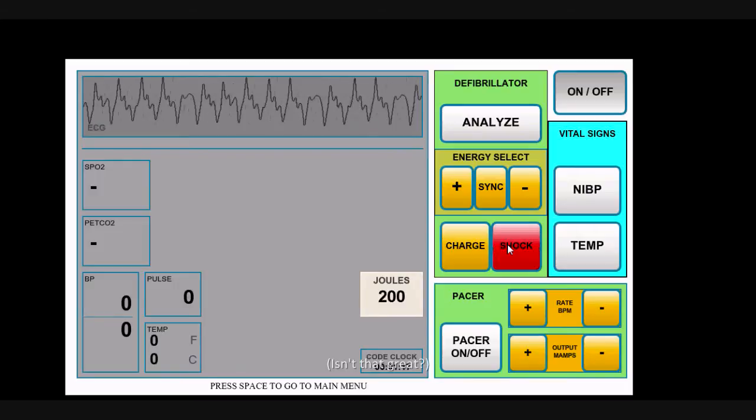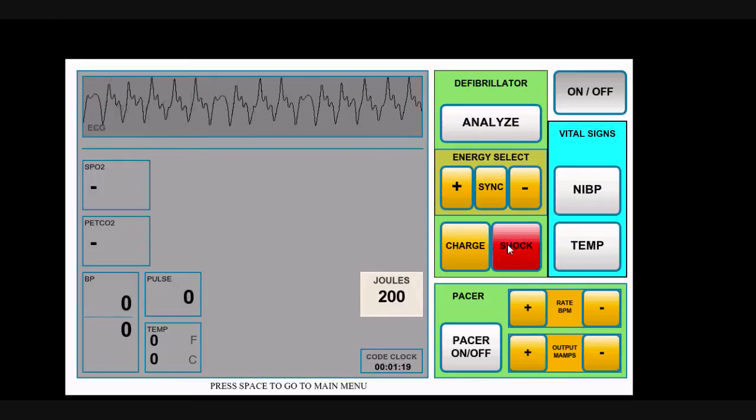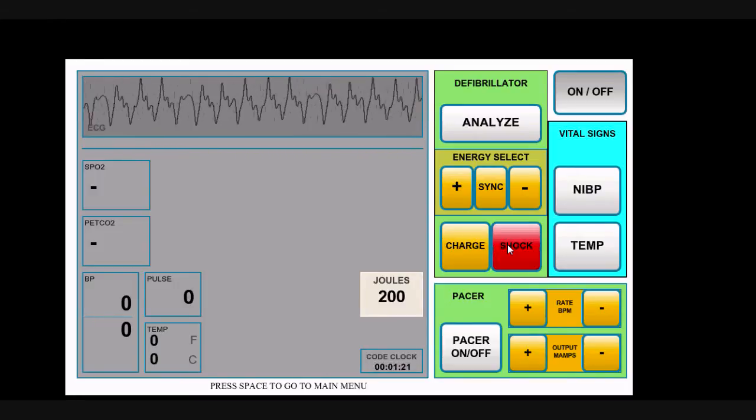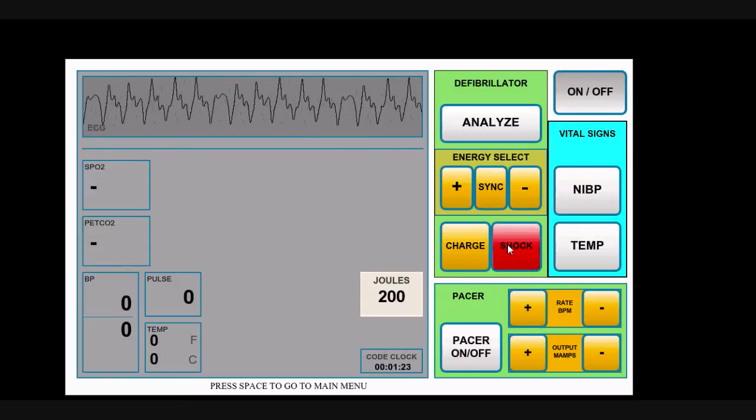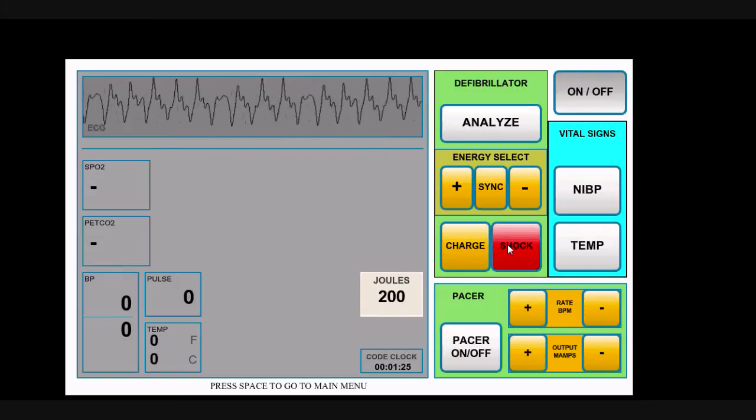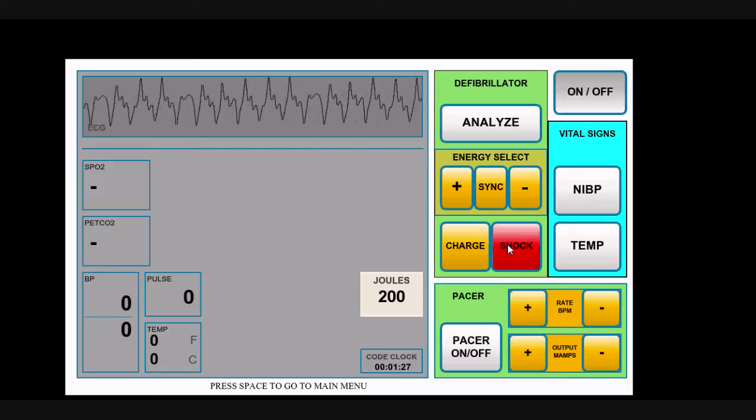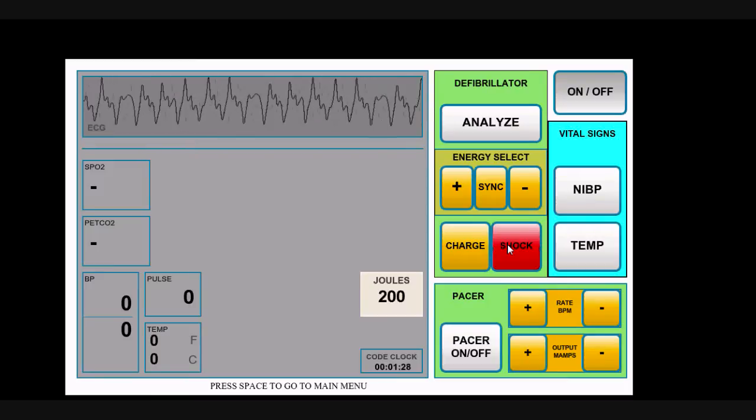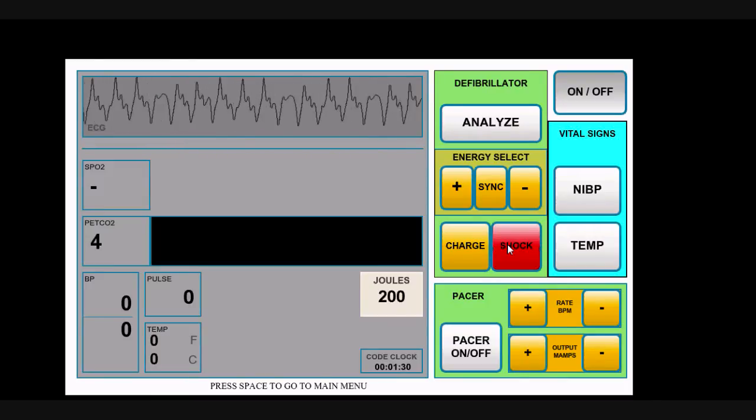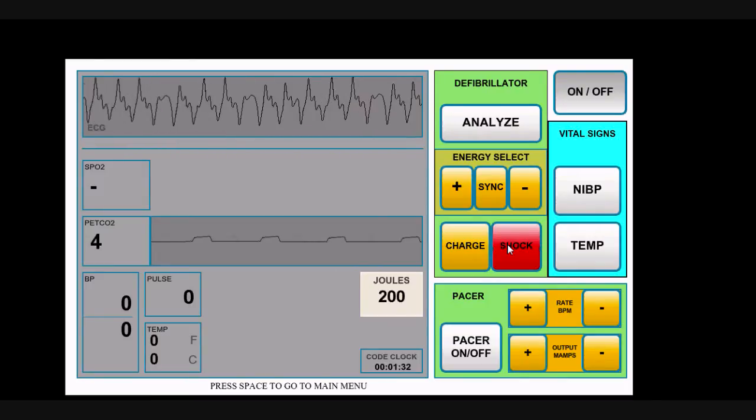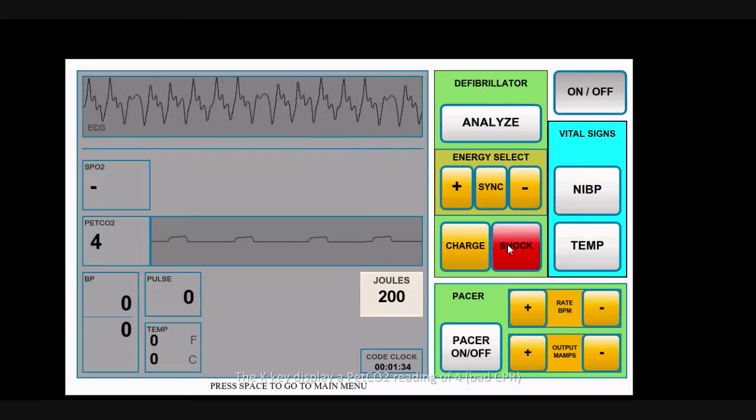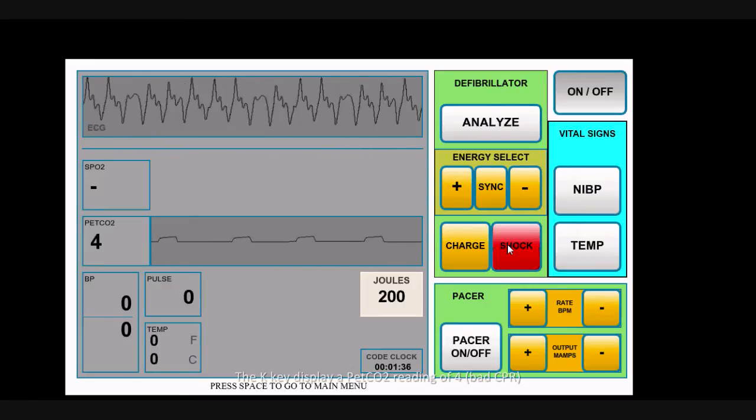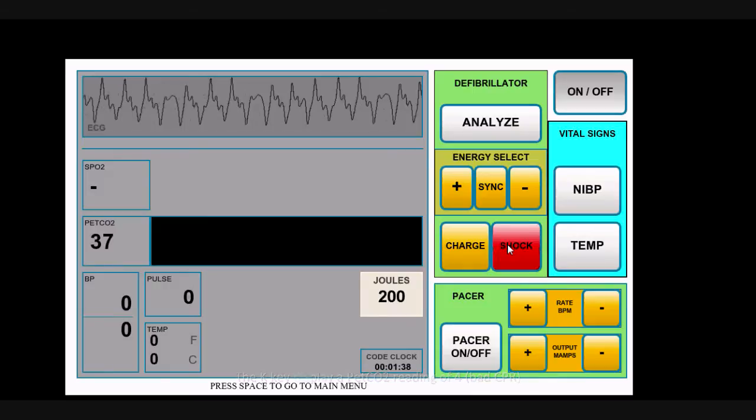You could put in your pressor at this point, or the students could. They can maybe intubate the patient if that seems appropriate. You can also throw up an appropriate CO2 detection. Let's say they've tubed them and they've put the capnograph on the patient. You can give them a low CO2 suggesting poor CPR, and when you see compressions that you like, you can increase the CO2 to a level that is more consistent with good CPR.